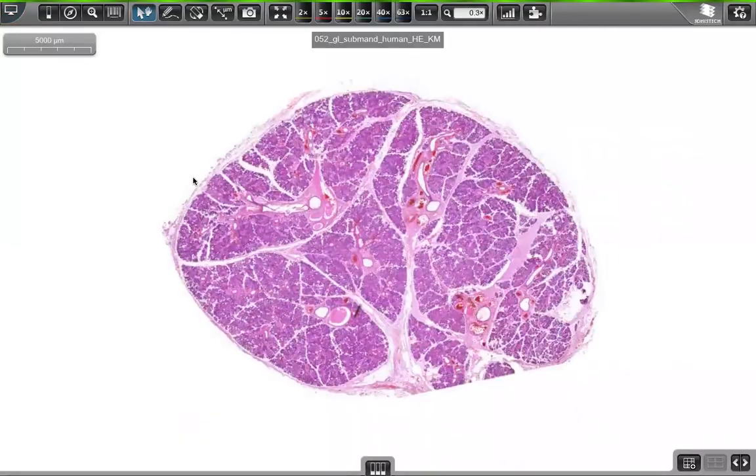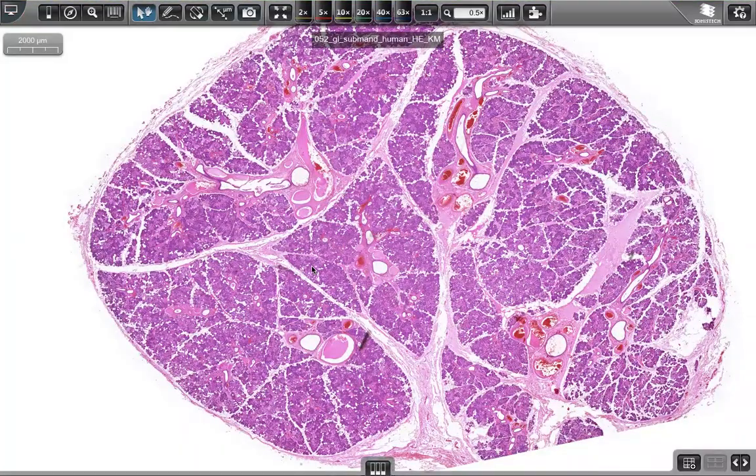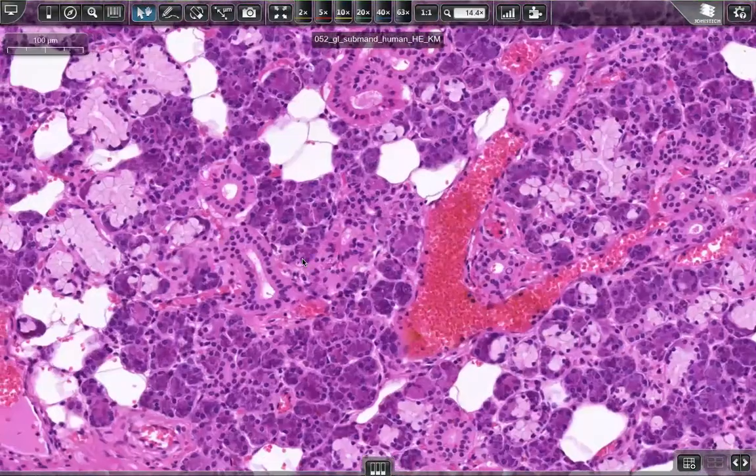You know, also frequently asked is the gland, the acini. So here we have the submandibular gland. It's a mixed gland having serous and mucous acini, but in the submandibular, the serous acini predominate. We have connective tissue septa dividing the gland into lobes, and from the wall of the lobes we have small structures called lobules. So let's see them. Here they are.